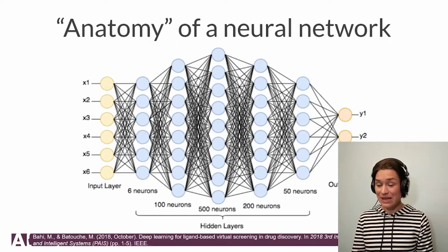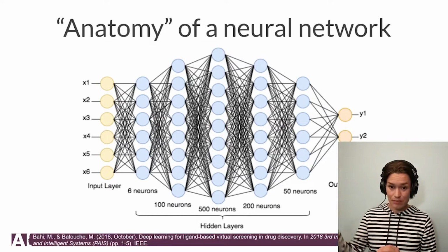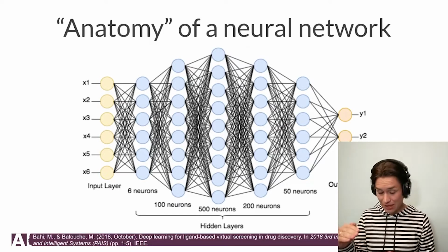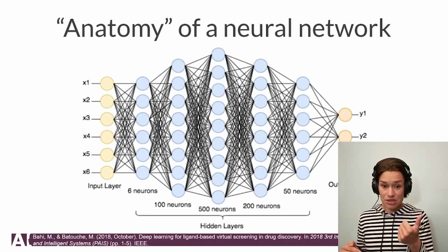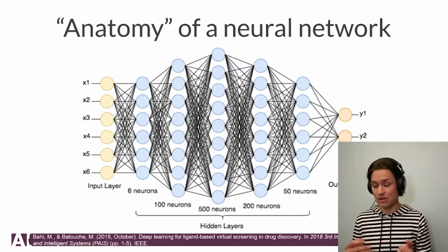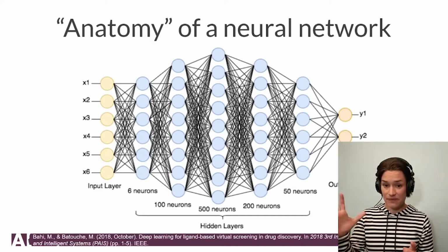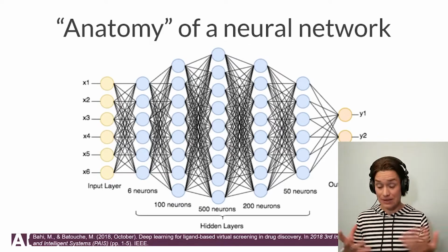But basically, we have the input layer where we put the data in, so we put our annotations in, and we have the output layer where something comes out. It can be a classification, it can be segmentation, it can be one of the different computer vision tasks. So we feed something in, and then we get something that we want out. And there are things happening in between.